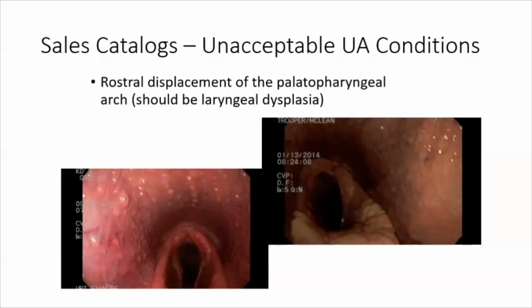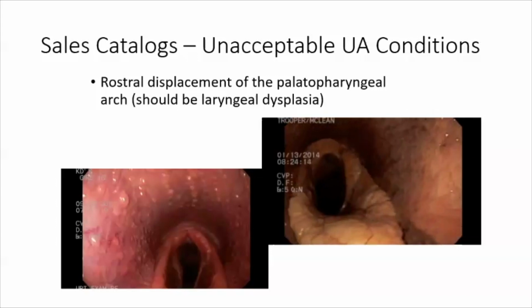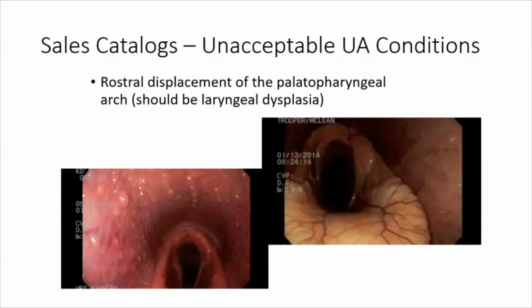In the video on your right, you can see that the horse's left arytenoid is not fully abducting. Again, that is on the right-hand side of the screen. That's the left arytenoid. But that's not fully abducting. And most people would say, well, this horse is a roarer. He's got a paralyzed left arytenoid. But it's very important to look at the whole picture, and anymore on any of the horses that come into our clinic, we ultrasound the larynx also. And we can tell with the ultrasound if the muscles are becoming paralyzed or if the cartilages are abnormal. And so that's how you figure out some of these things. So that's another unacceptable condition.